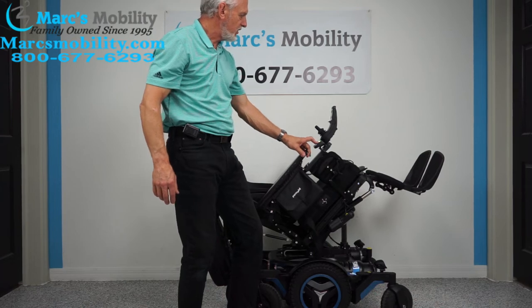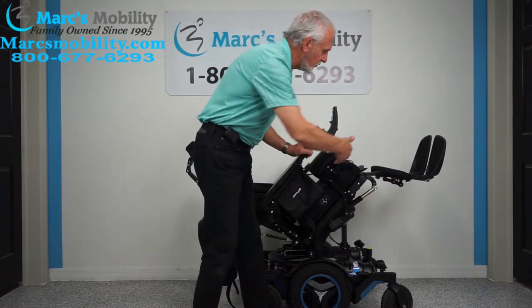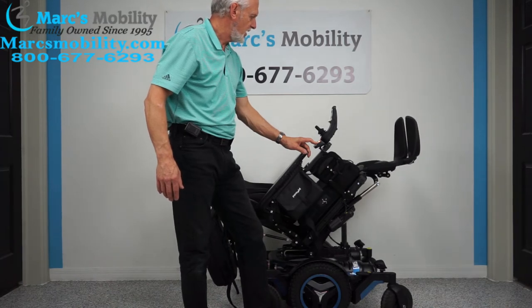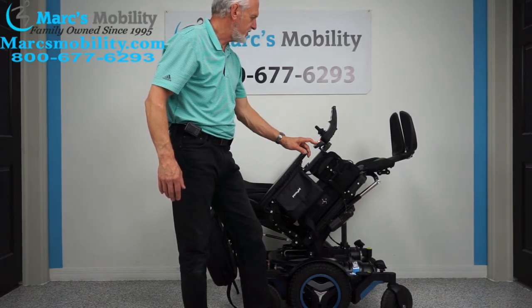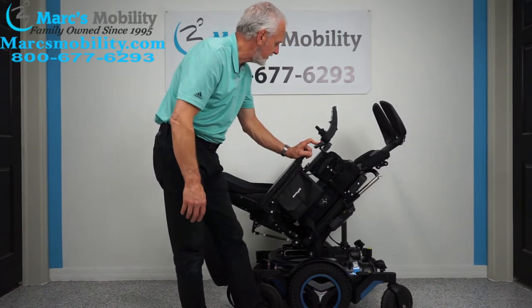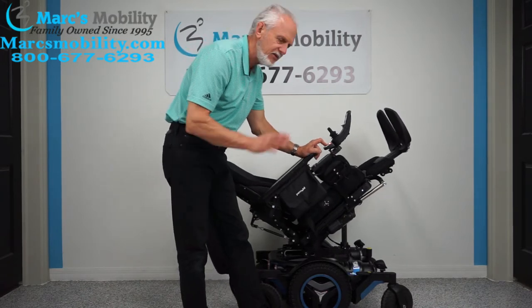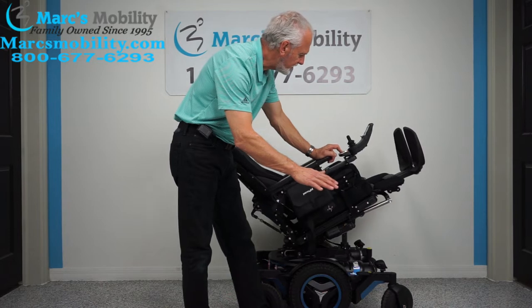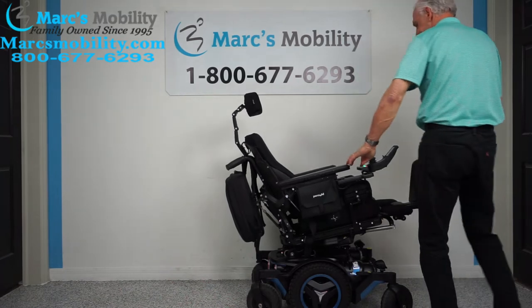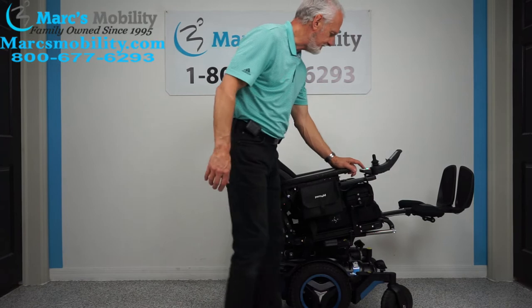The next feature is the electric legs. Whether you're five feet tall or six foot two, we can adjust these feet all the way out to accommodate you. For really good circulation — and this will be a little extreme — I want to show you how high you can get your feet in the air. Even if you're halfway tilted, you can still have good circulation, with your feet still higher than your body.